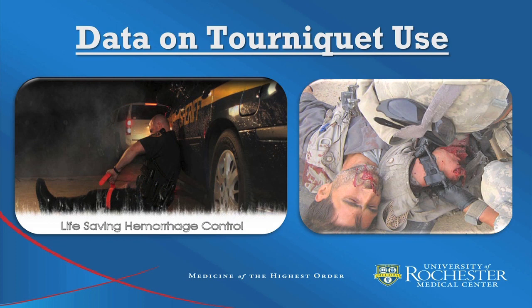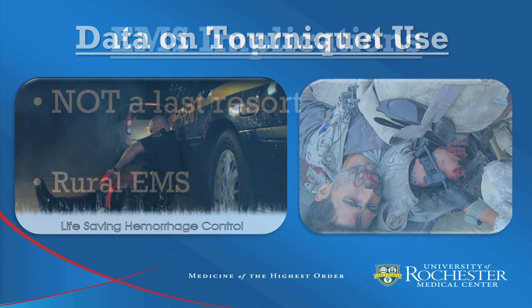Exsanguination, or life-threatening hemorrhage from an extremity, is a leading cause of mortality both in the military and civilian populations. The tourniquet has experienced a huge resurgence in the military. Current conflicts have generated large numbers of patients with extremity wounds that are alive today because of tourniquet use. With increasing violence toward law enforcement, police departments throughout the country now include tourniquets as standard duty equipment.